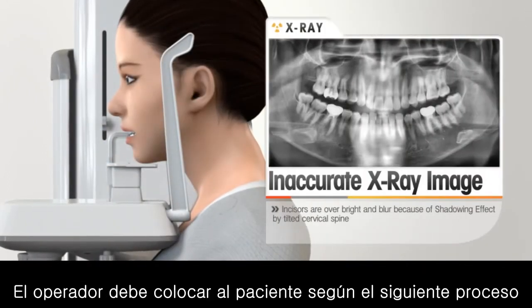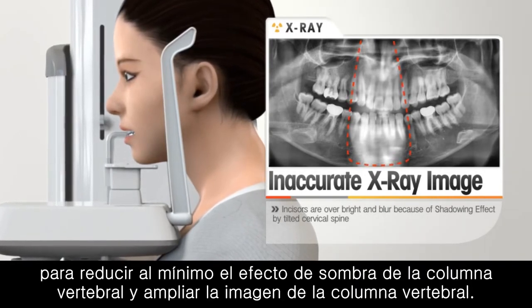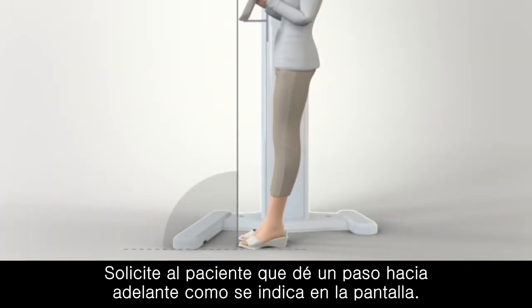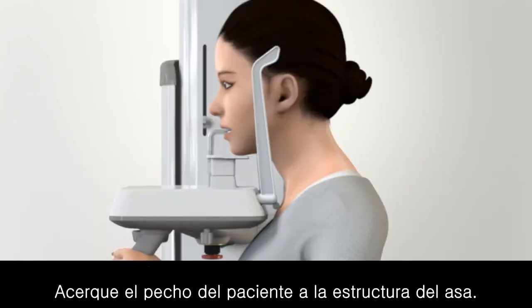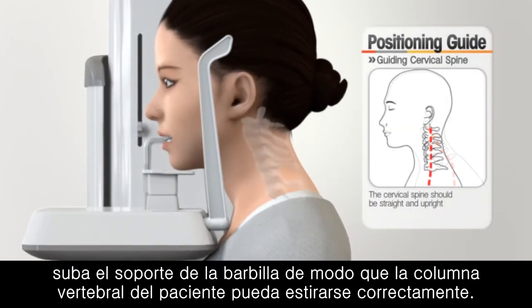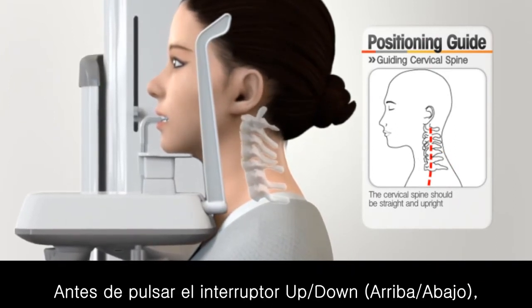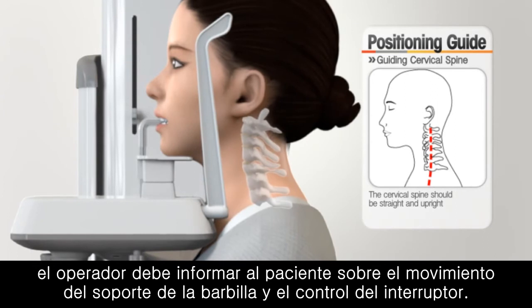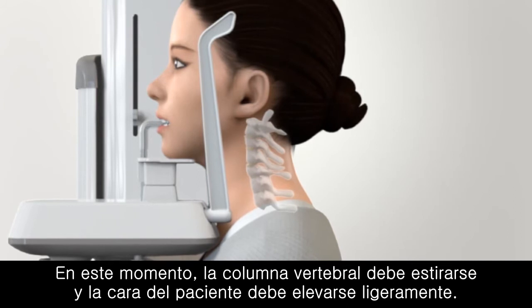The operator should position the patient according to the following process to minimize the shadowing effect of the spine and stretch the spinal image. Ask the patient to step forward like the screen. Bring the patient's chest close to the handle frame. Using the up-down switch, raise the chin support so that the patient's spine can be properly stretched. Before pressing the up-down switch, the operator should inform the patient about the movement of the chin rest and control the switch. At this time, the patient should be stretched up and the patient's face is raised slightly.